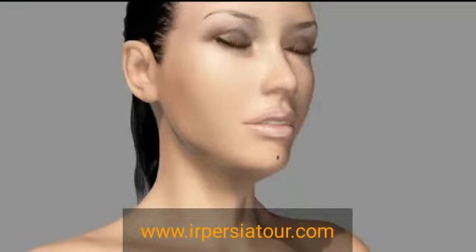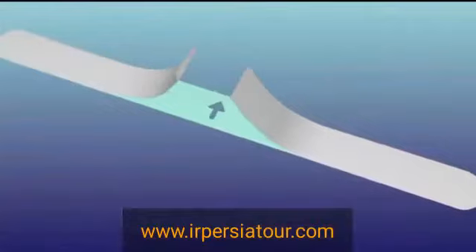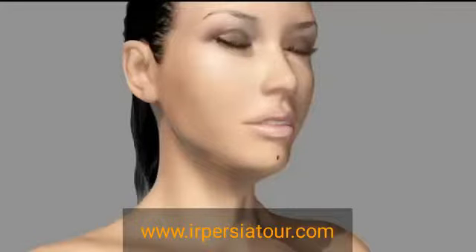The trampoline platysmoplasty is then placed after the neck-defining suture. This illustrates the tape that is used and placed along the jawline. This is included in the iGuide surgical suture system. As you'll note, there are alternating lines and dots.